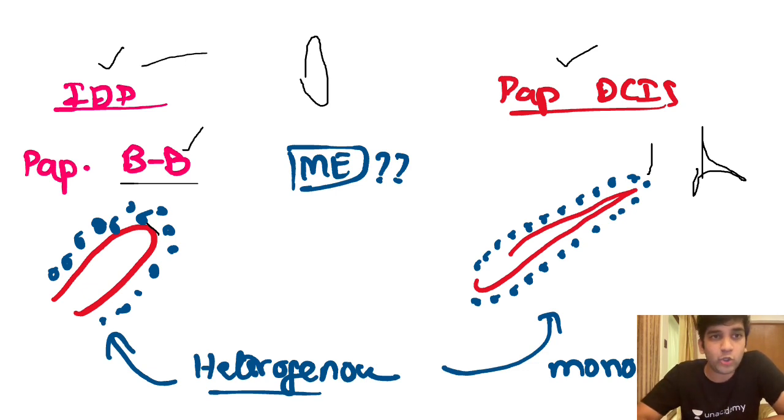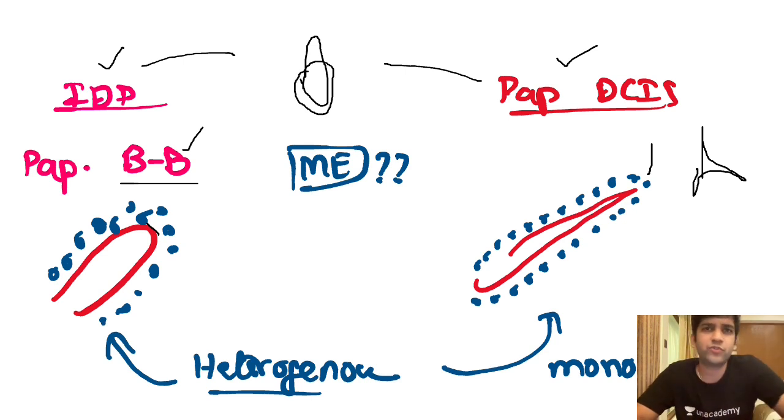So when I say papilloma with DCIS, these are the entities which are much more worrying for me. That's one reason I need to apply IHC. See, when I say papilloma with DCIS, the second entity, in this entire lesion maybe half or three-quarters of it is papilloma. Maybe in this tiny area, I'll have DCIS foci. So there is more chance for me to miss it if I go just by histomorphology, right? Still, you can pick them up. I'm not saying you're going to miss. You'll pick them up for sure, but to prove it, or if someone else does not accept that it is DCIS, I'm going to use IHC, right?